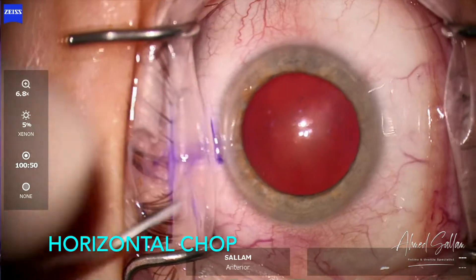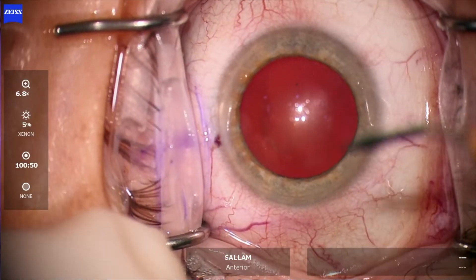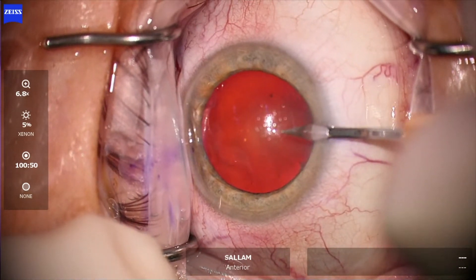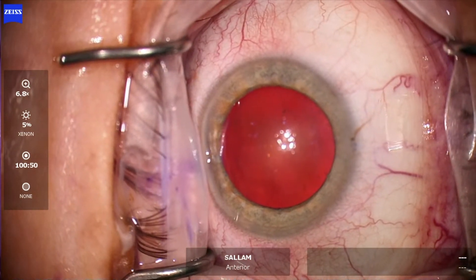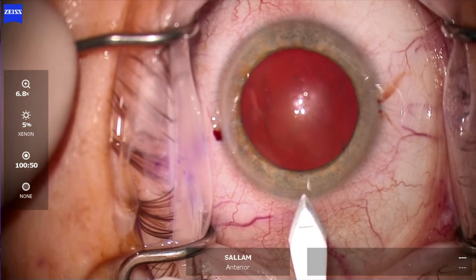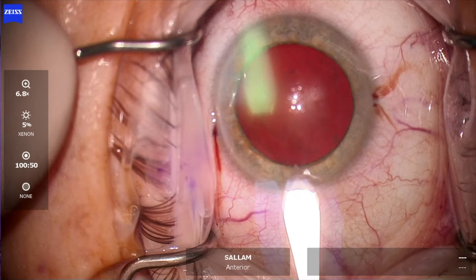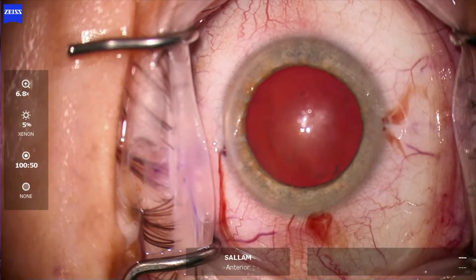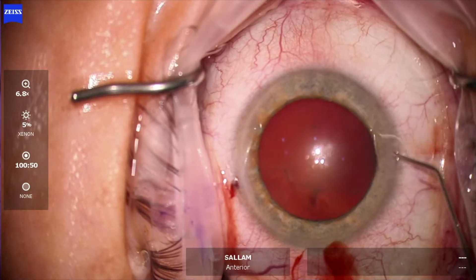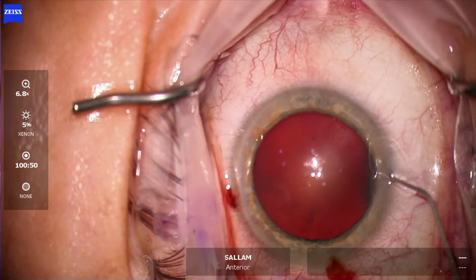This is a video of a horizontal chop for a nuclear grade 3 cataract in a highly myopic patient. Starting with the side ports — I do these first — then the main wound with the keratome; it's a uniplanar incision. This is also a topical anesthesia case, so intracameral anesthesia is used.